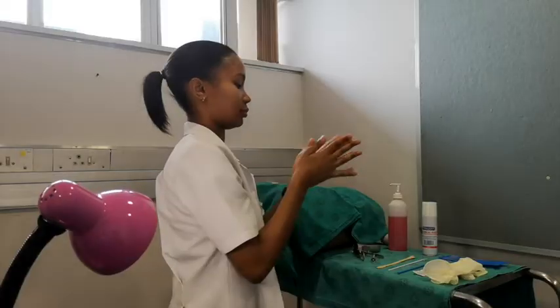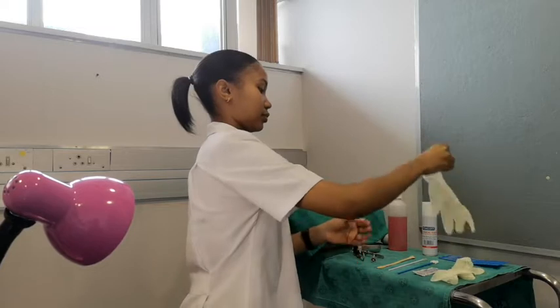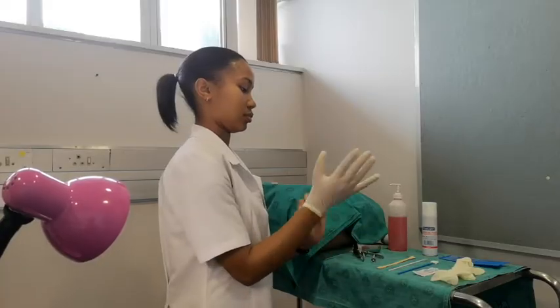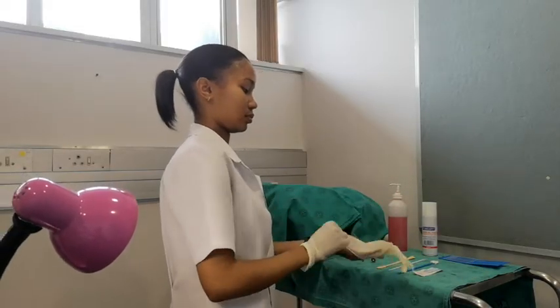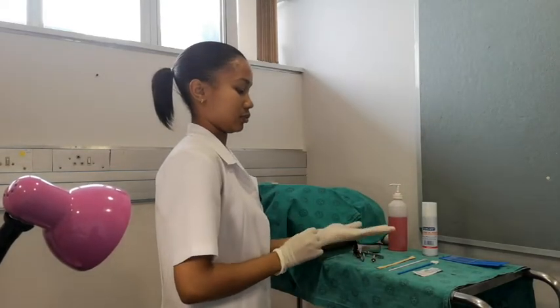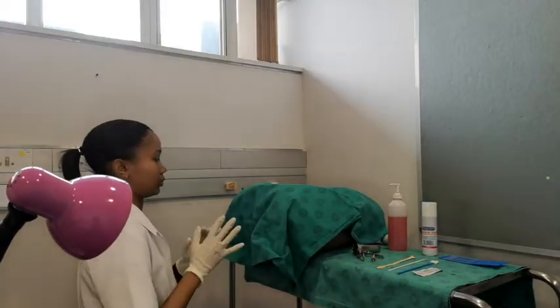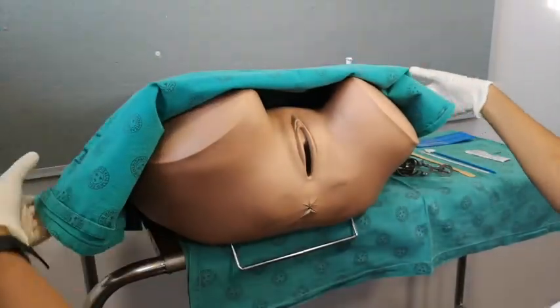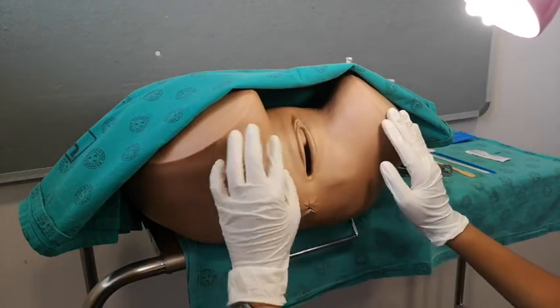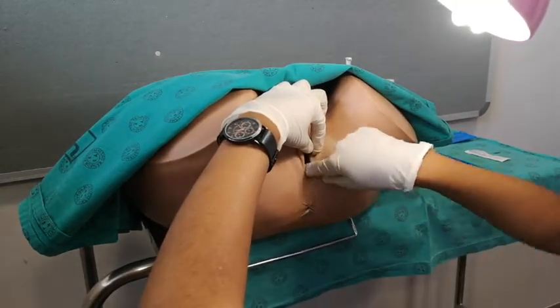Having gotten informed consent from your patient, start by washing your hands and wearing your examination gloves. Ensure that all your equipment is ready and that your lighting is adequate before you start. Warn the patient that you're about to expose them, then start the examination with inspection of the external genitalia and palpate the Bartholin's glands on either side.